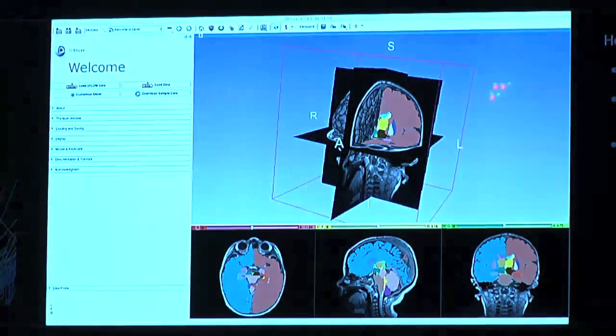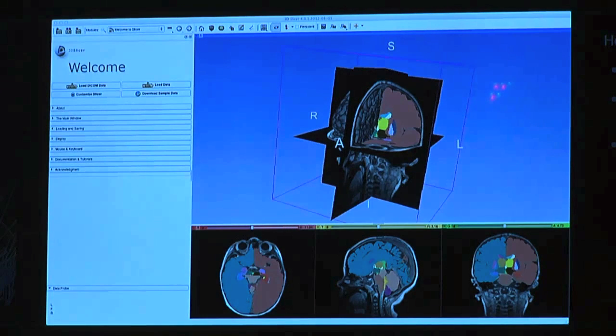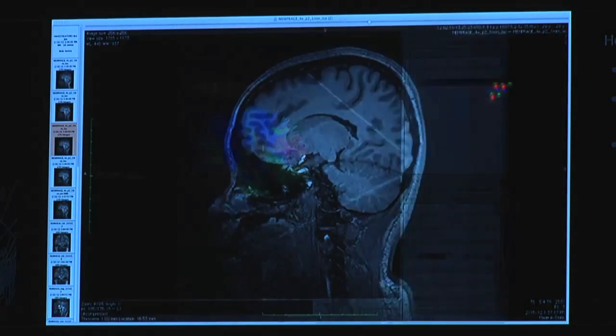So in the past, all this image processing and visualization was done with specialized software, which had to be installed. For example, 3D Slicer, which comes from Brigham and Women's Hospital. It's pretty popular in the medical imaging field, and it's platform independent, but you have to install it. It's a big package. Or Freeview, which comes from MGH, Mass General Hospital, and Osirix from Switzerland, or TrackVis.